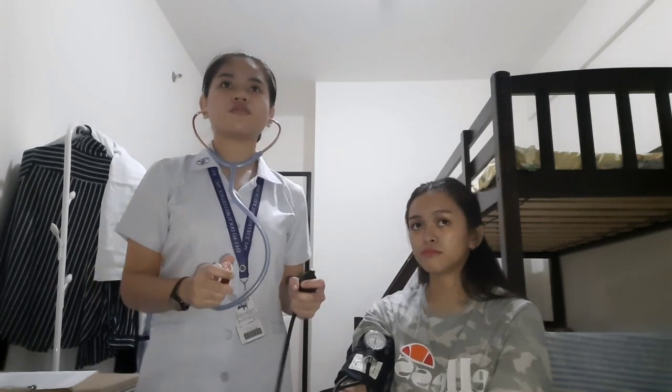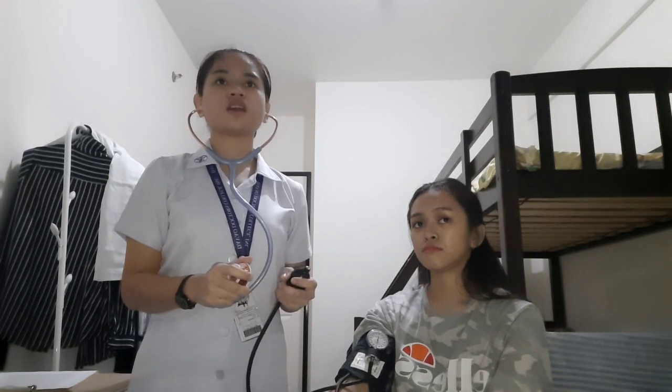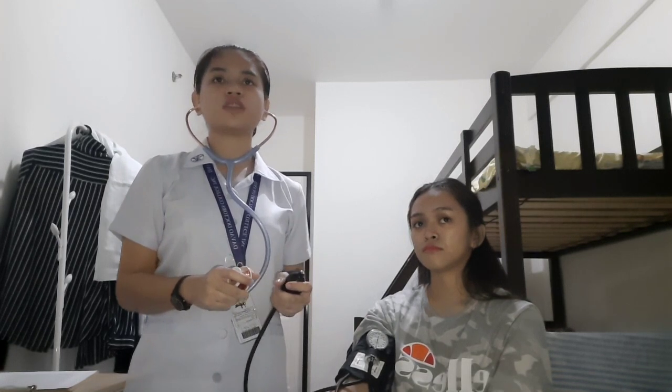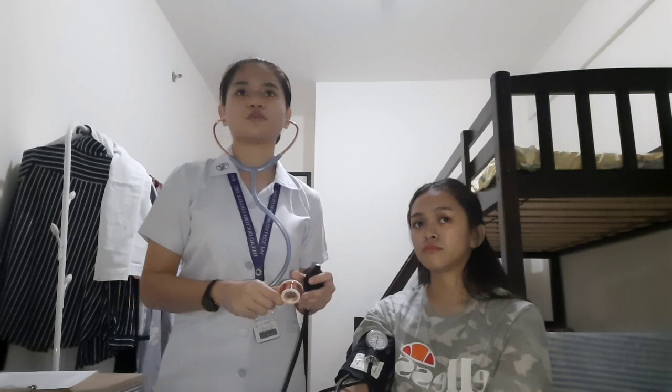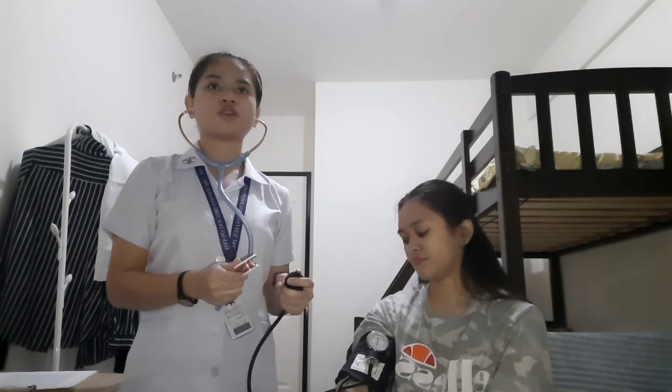I place the diaphragm of the stethoscope over the brachial pulse site. Place the stethoscope directly on the skin, not on clothing, over the site. Hold the diaphragm with the thumb and index finger, with the rest of the fingers supporting the elbow. Then I will auscultate the client's blood pressure. Pump up the cuff until the sphygmomanometer reads 30 millimeters of mercury above the point where the brachial pulse disappeared.